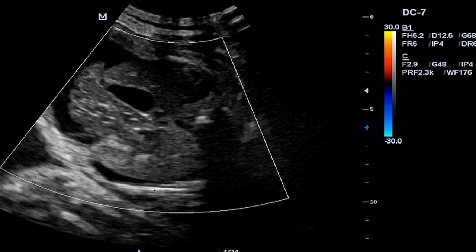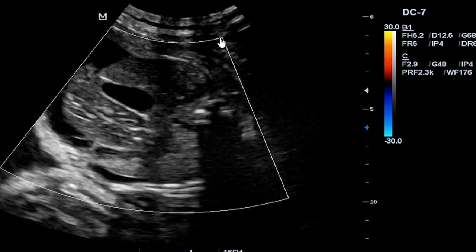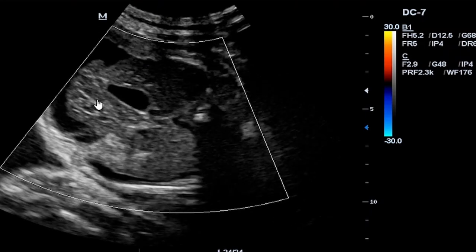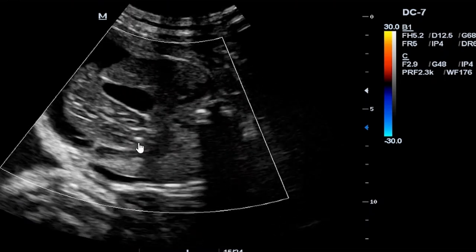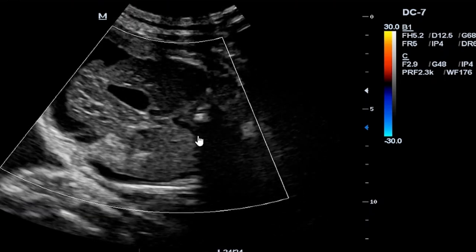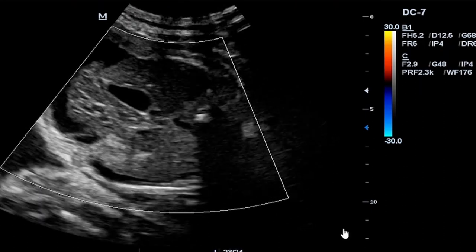On Doppler interrogation, we are supposed to see blood flow. There are major vessels that perfuse the abdomen and the extremities. In this case, on our Doppler, we are not seeing any flow to show that there is perfusion in the aorta or the inferior vena cava. There is no blood flow that we can see.